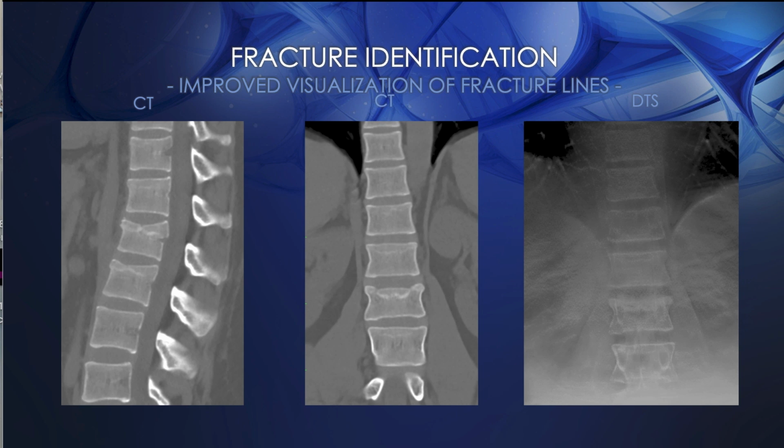And it also illustrates how familiarity with looking at the images matters. There's a misconception that just because you read CT and you read radiography, you should be able to read tomosynthesis. Yes, those skills help you, but it's a totally different modality, which speaks to its strength in showing us things that those other 2 modalities don't, and also underscores why there should be a focus on education and training in this modality, because it's worth it. There really is a lot to offer.